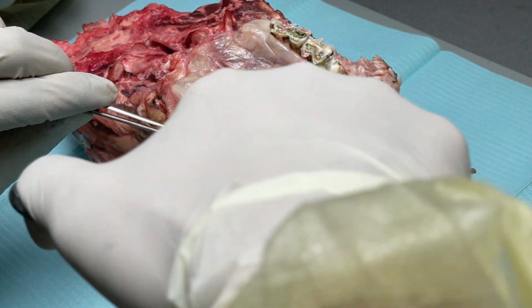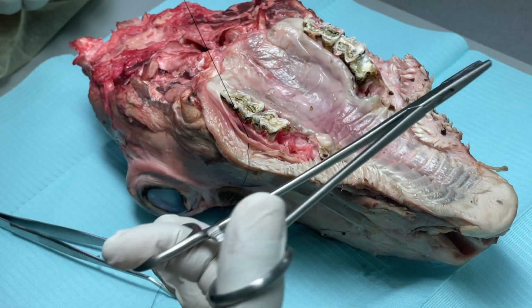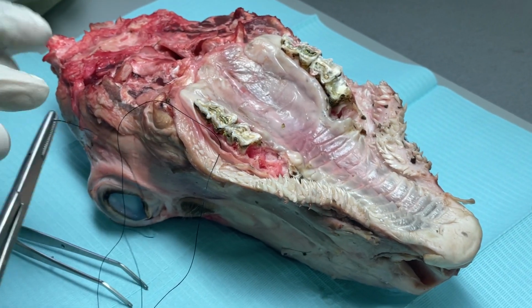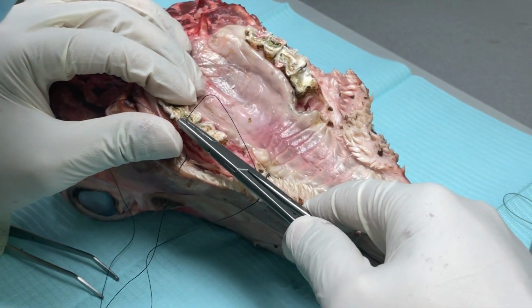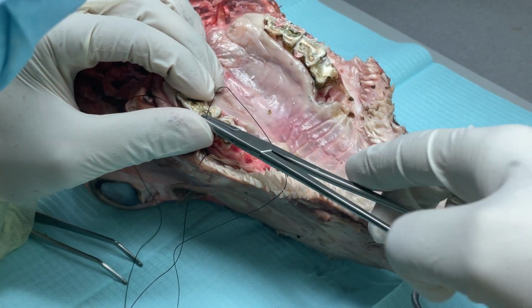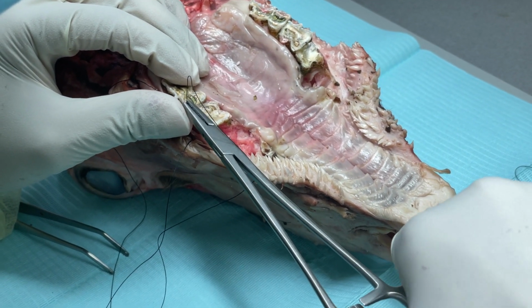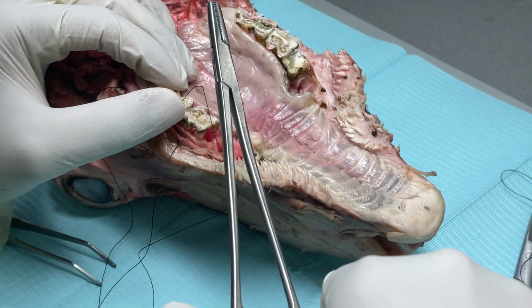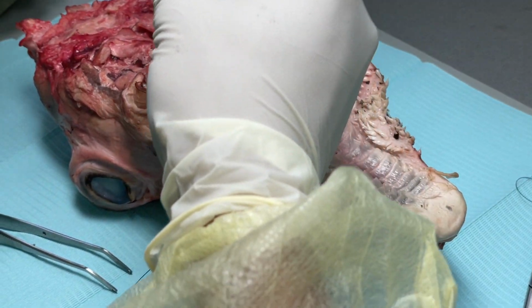Released it, hold it. Bring it out. Initially you can leave the remaining there, no problem. Let me just pass it interdentally. It has to come out. Earlier I got a point where it came out. In our human teeth it is easy to pass it interdentally, so you won't have a difficulty. Okay, got it.